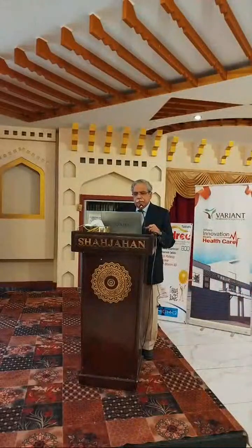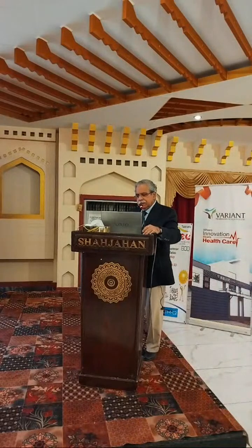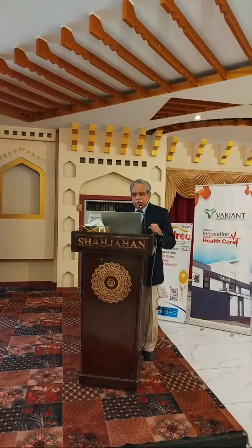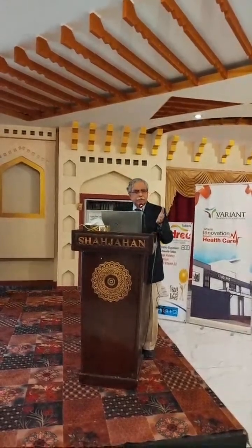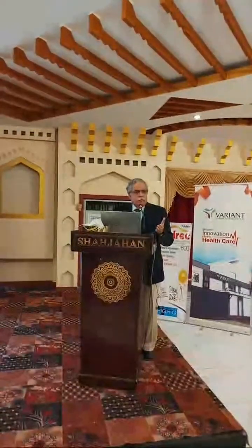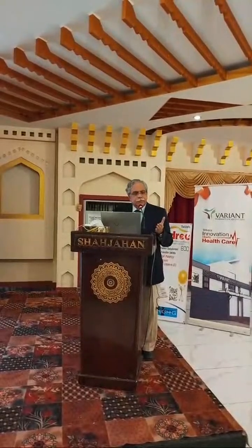Okay, so this will also give you, like I said, information about what the characteristics of the vascular bed is like. And so, on a very basic level, if we are talking about the vascular bed that follows your site, for example, when we are looking at the umbilical arteries, we are looking at the characteristics of the vascular bed beyond the site, which is the placenta. And so you need to look at the diastolic phase.